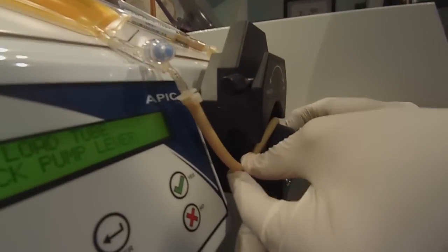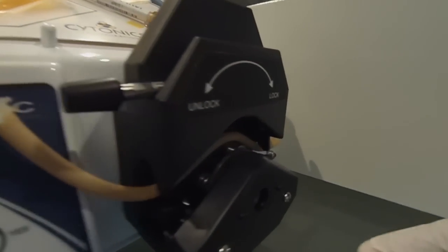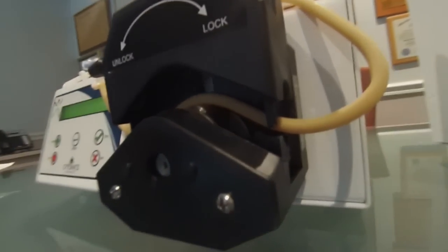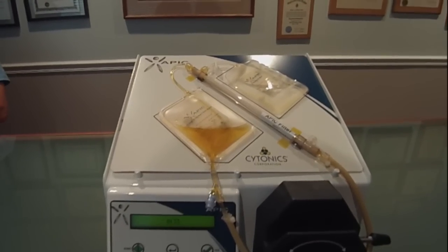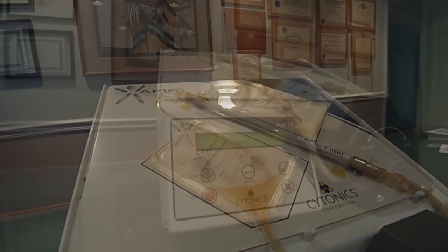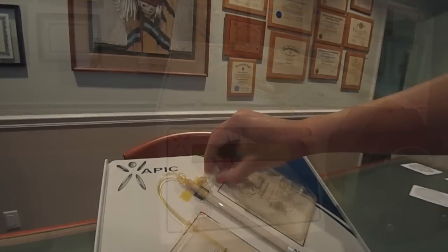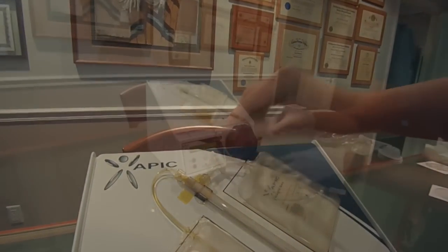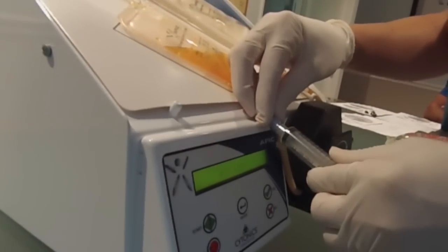Load the tubing into the pump head by securing the tubing between the tubing retainers on each side of the pump head. With the tubing properly secured, lock the pump lever. Press start to begin the 20 minute cycle. The waste bag will begin to fill up as the volume in the concentration bag decreases. Once the cycle is complete, the pump will read APIC ready. Close the clamp on the waste bag and the concentration process is complete. Alcohol wipe the blue port and connect the syringe to withdraw the APIC.